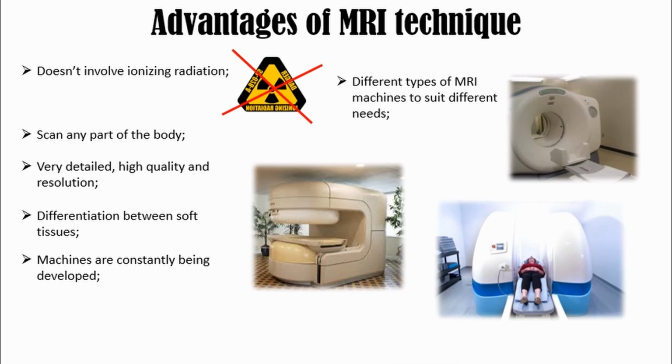And the last MRI advantage is that the technology is being constantly developed to give even more clear and more accurate images in a shorter period of time.